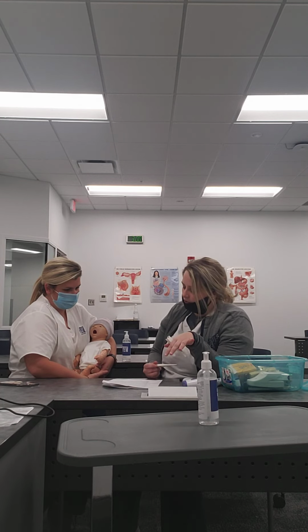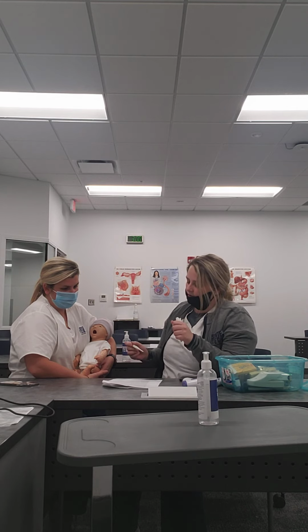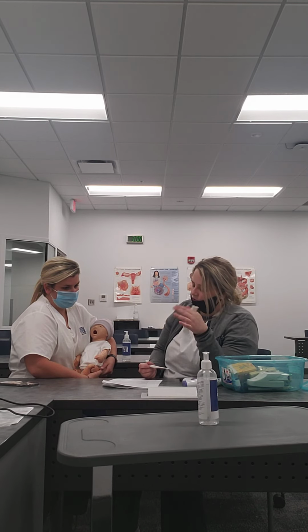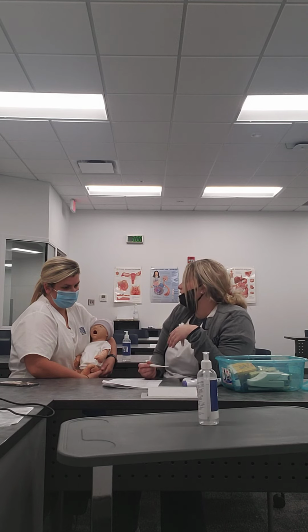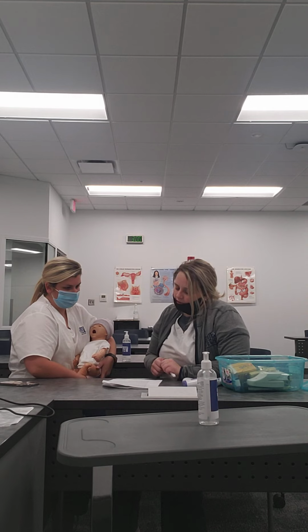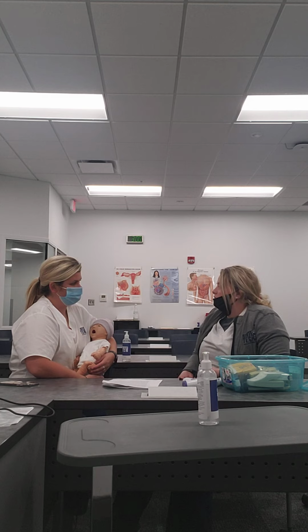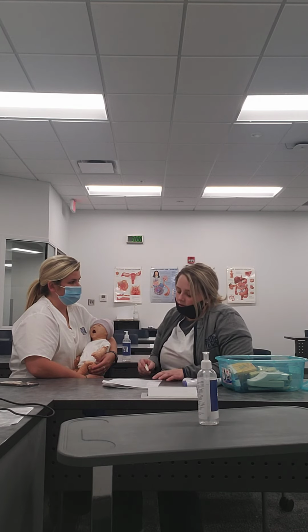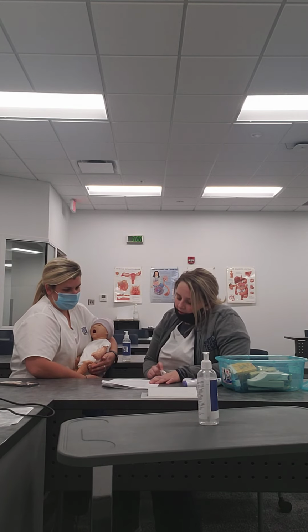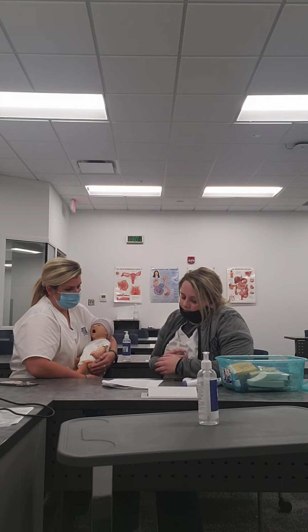You're gonna lay your baby or child on his back, lift the thighs, and insert the lubricated thermometer. They say 1/2 inch to 1 inch, or 1.3 to 2.5 centimeters. I would suggest just going by the inches. It's a little bit easier. Yeah. You can place your child on your belly, if you want to, you can also do that. On your belly? Yeah. Oh, yeah. Okay, I see what you're saying. Yeah. But put their head against his or her lower back to hold the child in place.